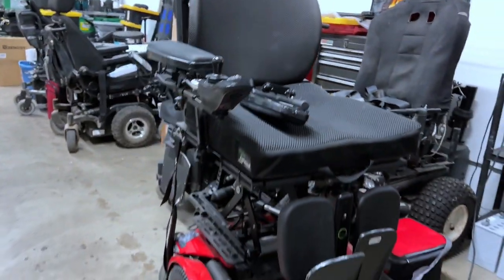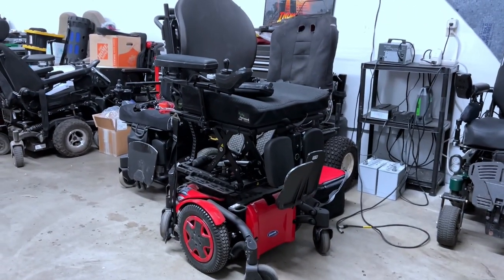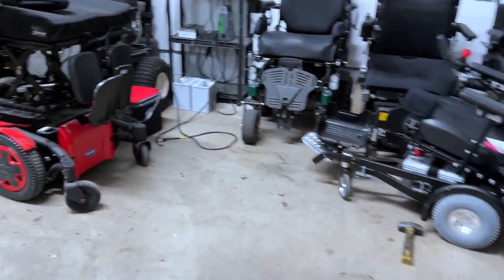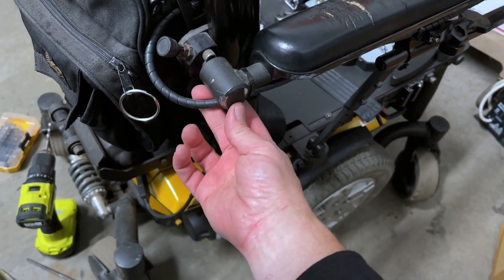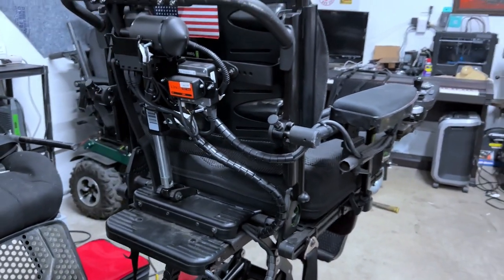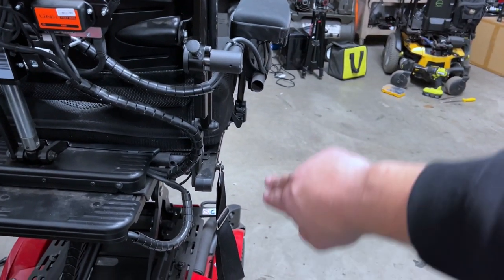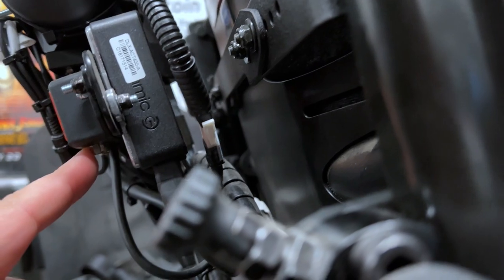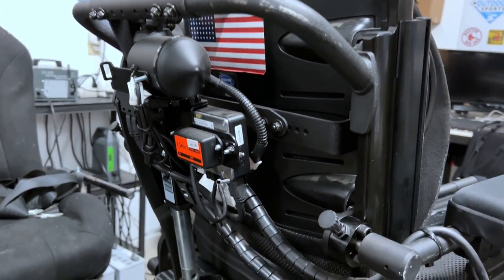Next I'm going to play around with these armrests — we've got a little bit of room to play with, and that's just fabric so I think I can pull this in one or maybe even two notches. There are three different mounting spots for the arm bars, so let's play around with that and then I think we're going to be done. I'll hop in this and see if it fits me. I really do like Motion Concepts seating — it's very comfortable. I do have these arm bars but the covers are trash — I'd have to replace those. Right now our armrest is sticking way out past our tires and that is not what I want.